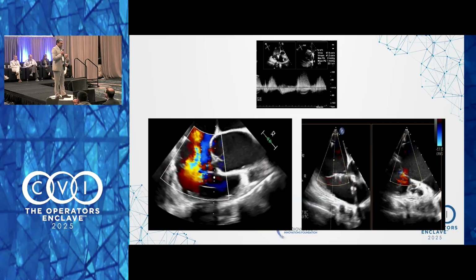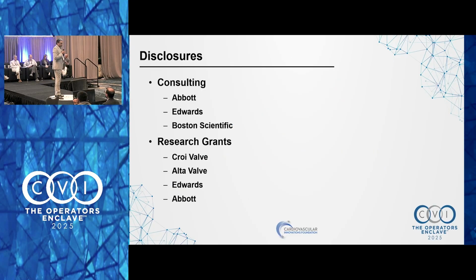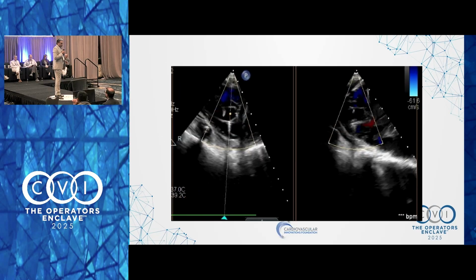Do you think the RV got better too? It did. Yeah, because that's the other issue with this RV pacing with the leadless: the RV gets worse and the TR gets worse.